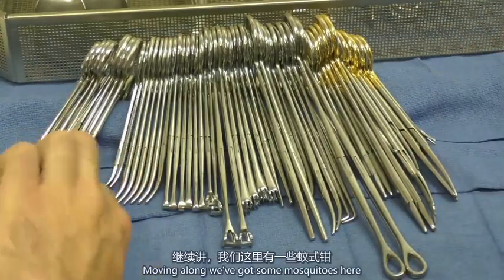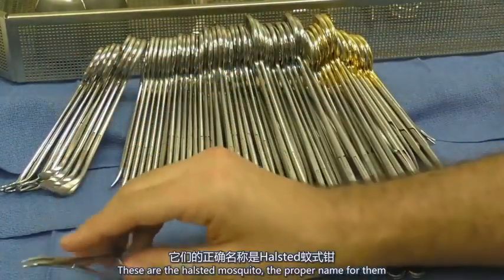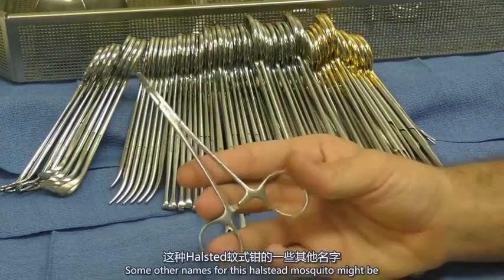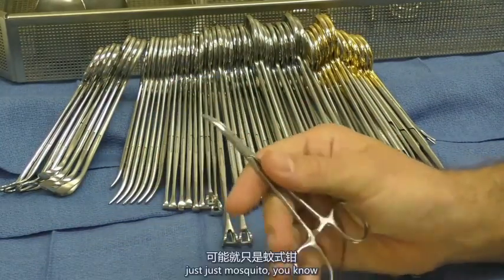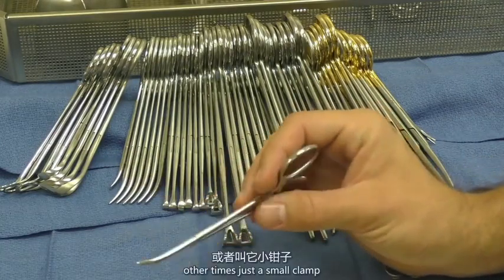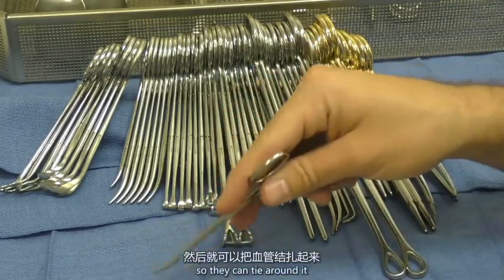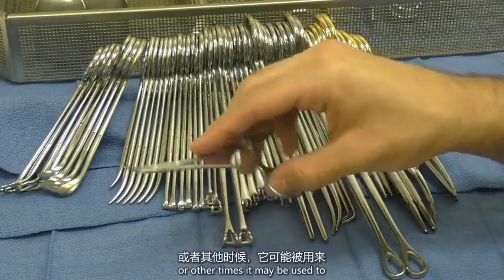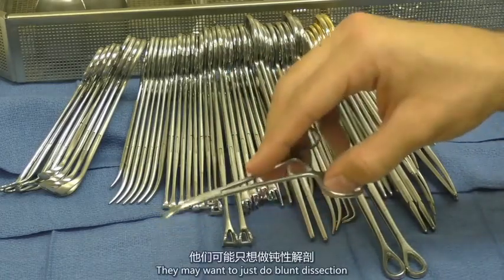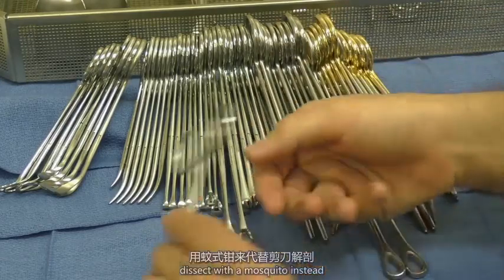Moving along, we've got some mosquitoes here. These are the Halsted mosquito, the proper name for them. Some other names for this Halsted mosquito might be just mosquito. Sometimes they'll just call it a mosquito. Other times just a small clamp. They may use it to clamp off a vascular structure so they could tie around it, or other times it may be used to dissect. Instead of using a scissor, they may want to just do blunt dissection, and they'll be able to dissect with a mosquito instead.